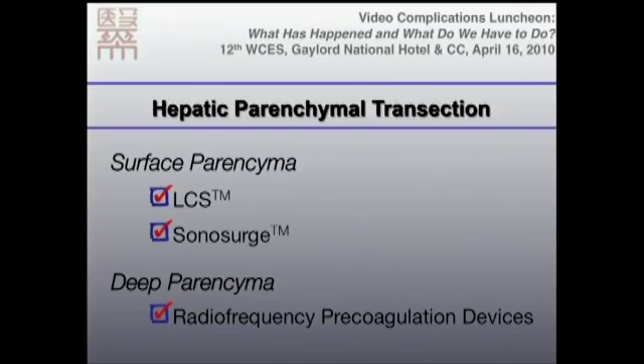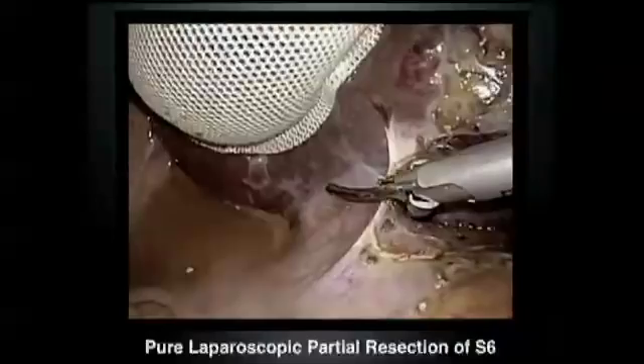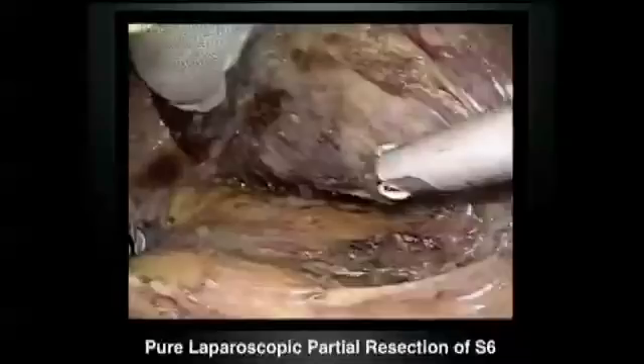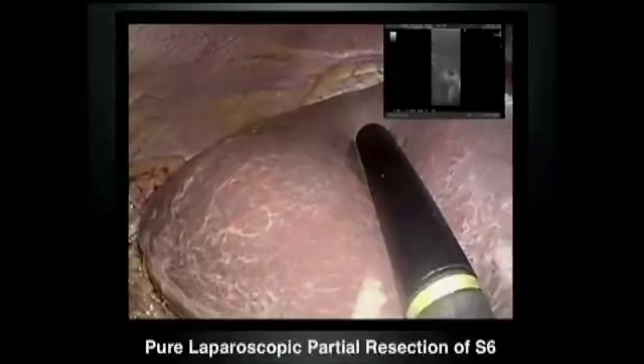This is a typical example for partial resection of segment 6. This is a 91-year-old male with simultaneous colorectal metastasis — a solitary lesion located on segment 6. So we decided to perform a laparoscopic partial resection of segment 6.